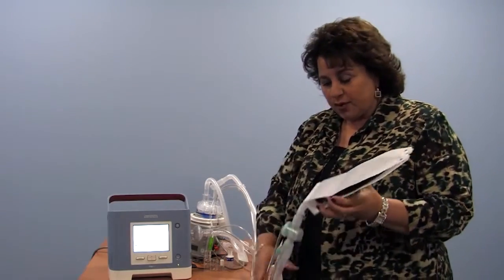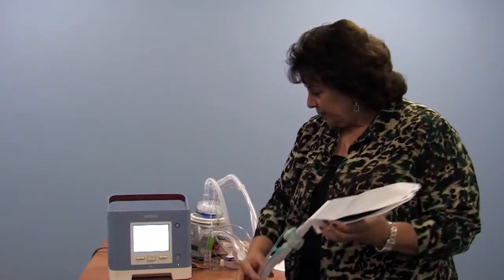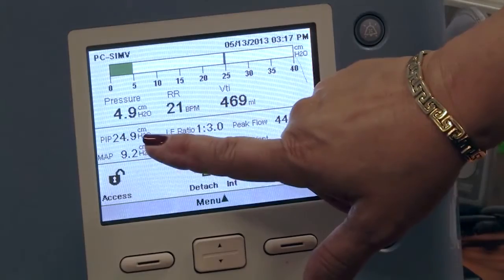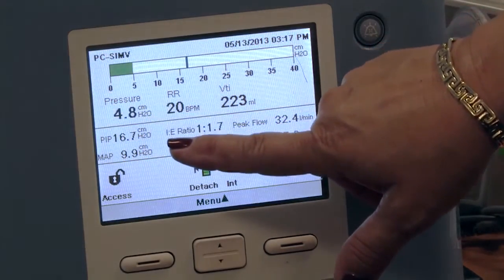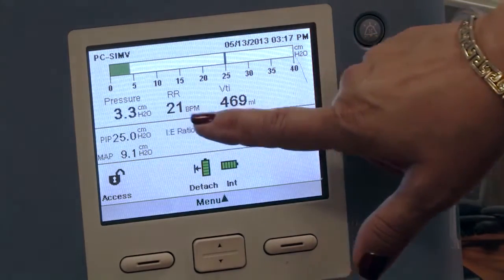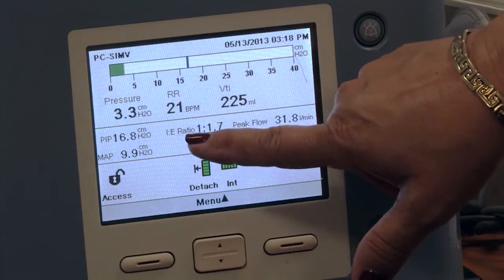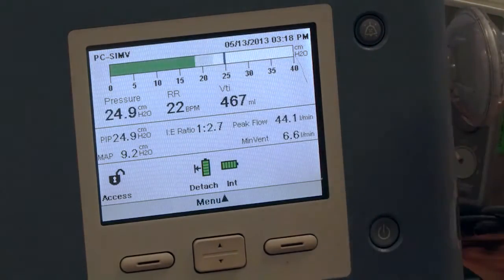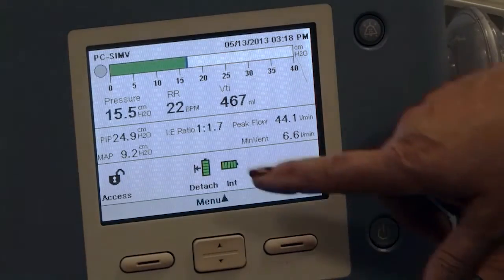So other numbers that you observe when you watch your child utilizing the Trilogy 100 ventilator in the pressure control SIMV active mode, a circuit with an exhalation port in it, are these numbers in this second box. We see the PIP, that means the peak inspiratory pressure, and that should show us approximately the 17, which is the top pressure for our pressure support breaths, and also 25 for the top pressure of those 8 mandatory breaths that our patient is receiving.